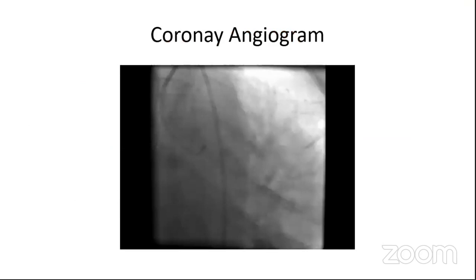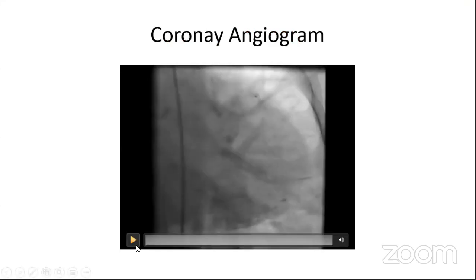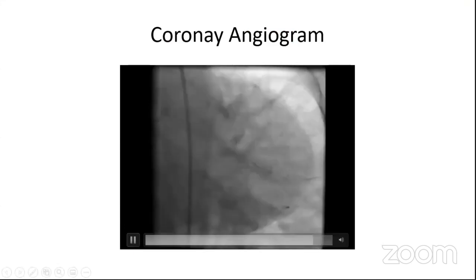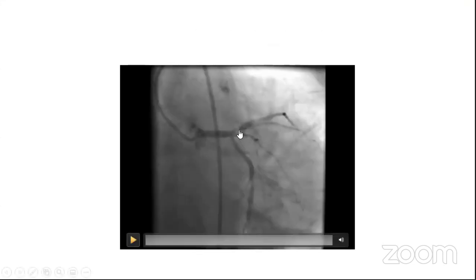So this was her coronary angiogram. This is a Judkins left 4 diagnostic catheter through the right femoral artery. You have a very long left main, as you can appreciate here in the caudal views. This left main gives a subtotally occluded LAD involving or not involving a diagonal that we will see. And the circumflex is giving rise to a very high OM, which you may consider as a ramus intermedius, but it will be apparent in another view that it is a very high OM.